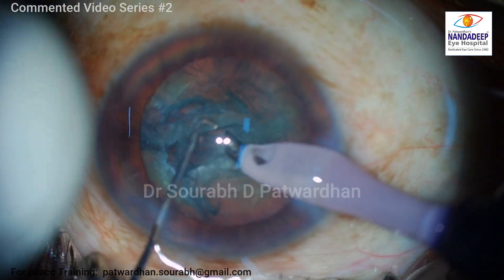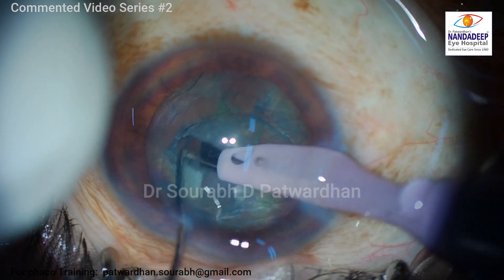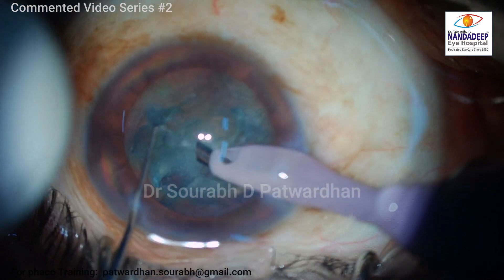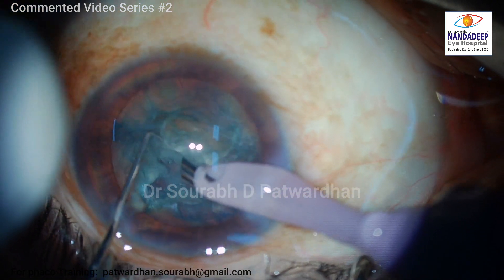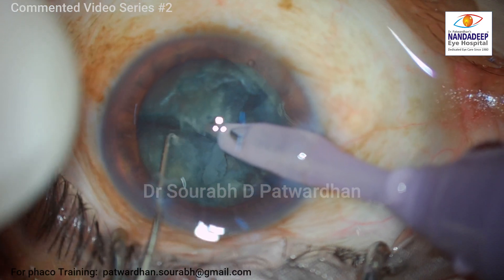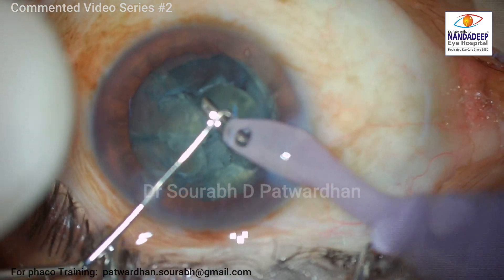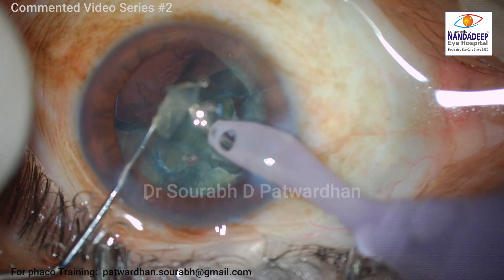I could crack it easily — it is around a grade one to two cataract. I decided to continue with the trench divide. I also shifted my illumination to the retro illumination mode because I want to see the change in color. Now I can gauge the thickness of the lens well after trenching, and I can chop — avoiding burying the FACO tip too deep, just a little bit buried, then chopped, and started quadrant removal.